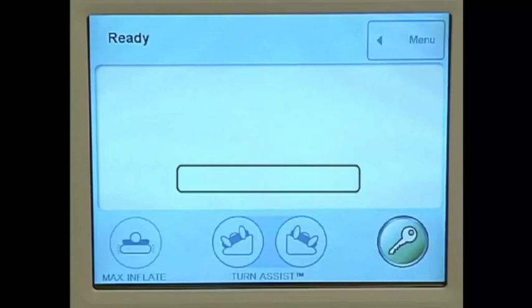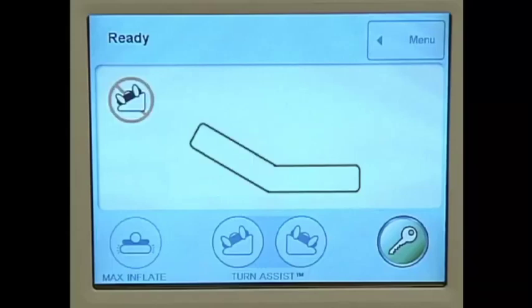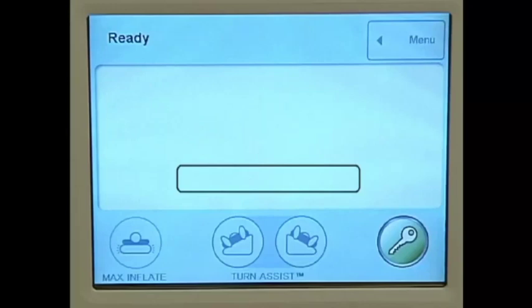When the air supply unit is on and the surface is inflated, the Ready screen appears to indicate there is no patient. If the head of the bed is above 30 degrees, the surface image is angled. The surface image is flat if the head of the bed is below 30 degrees. Notice that Enable is the only active bolded control. All others are shaded, which means they are locked. This helps prevent other features from accidentally being turned on or off.